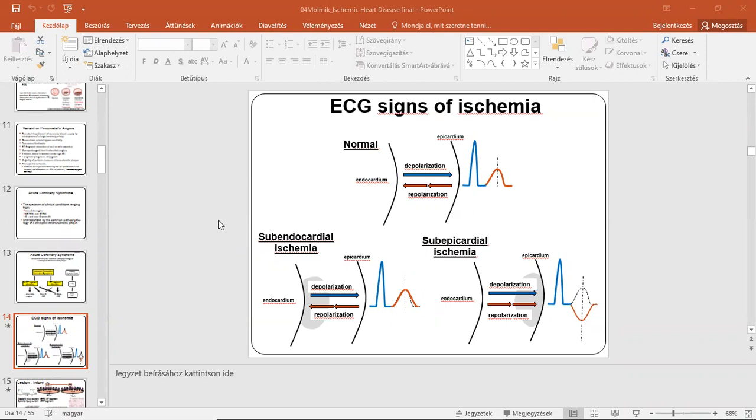and that's it. This is what the sign is. The worst thing is usually when someone has premature beat formation during exercise, because regularly, during the exam period, you can have premature beat formation, but at rest, not by effort. So if you do see some effort-induced arrhythmias, that can be a bad sign for ischemic heart disease.